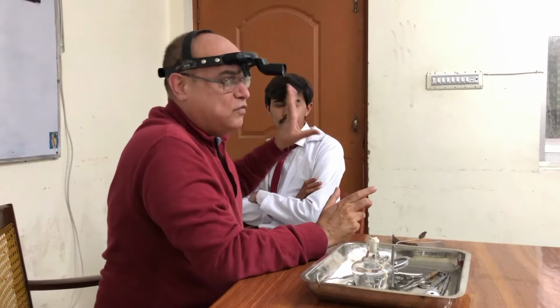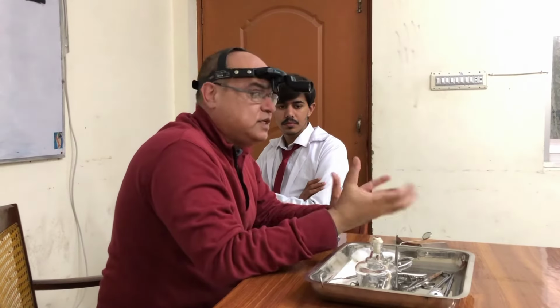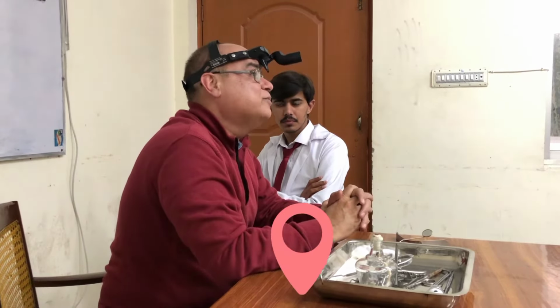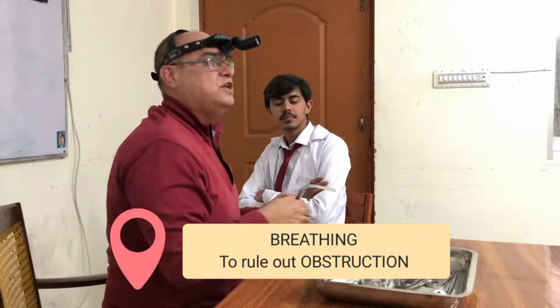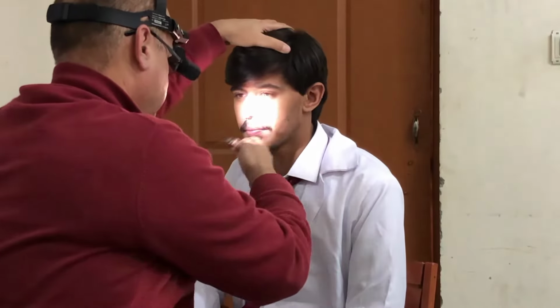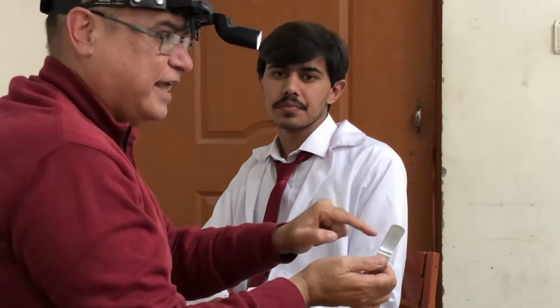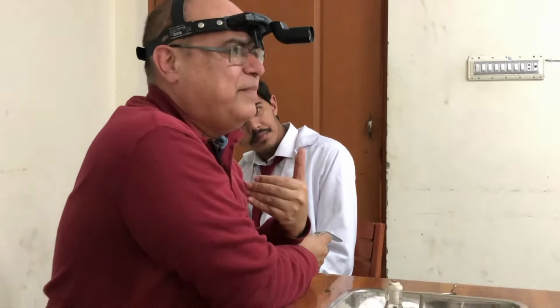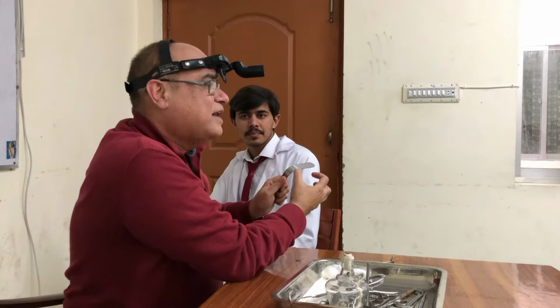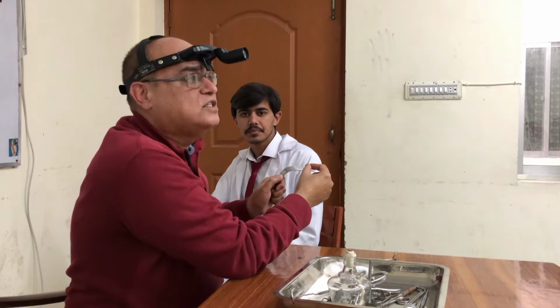Okay? Cosmetically we have seen the external nose at the start, and then we will see the airway, because mainly its purpose is as an airway, so we have to check whether any obstruction is there or not. For that, again we can use this tongue depressor. You can see the fogging is there. You will ask the patient to take a deep breath and then expire, and you can see the fogging over the metallic tongue depressor on both sides, whether it is equal on both sides and whether it is decreased or not.